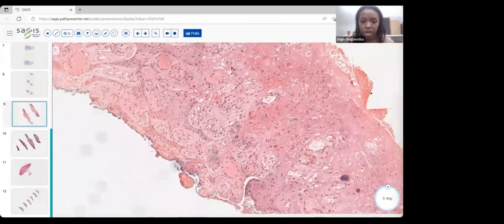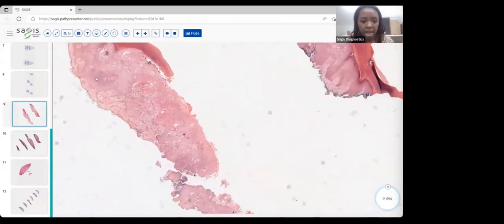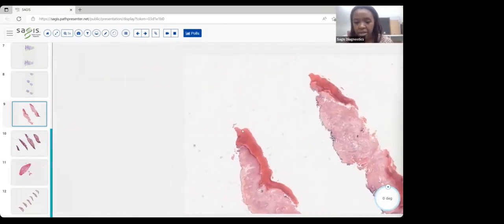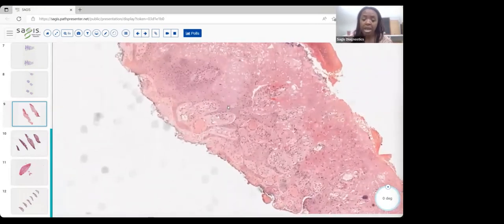But what's very striking in this particular diagnosis is how you have this epidermal stranding that seems to be creeping down into the dermis. And of course, that's very different from how we expect the epidermis. Obviously, there's also some acanthosis, but we don't have that pattern typically. All right, so this is part of the diagnosis that is somewhat histologically diagnostic in the appropriate setting. Okay, so this is an example of orf, right? Like molluscum contagiosum.